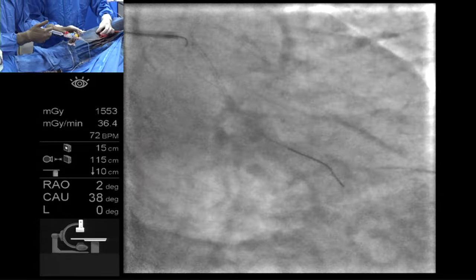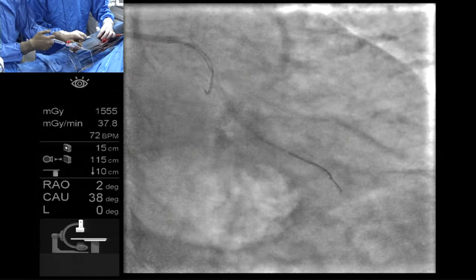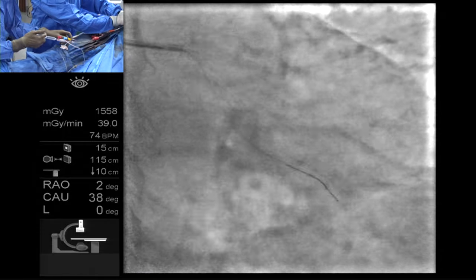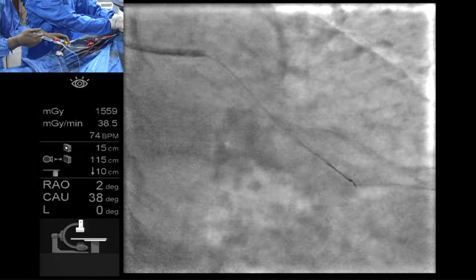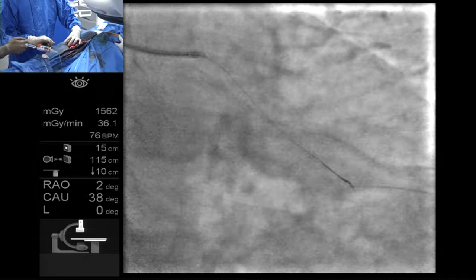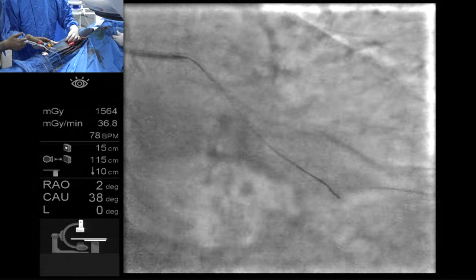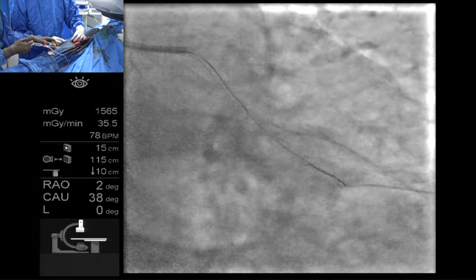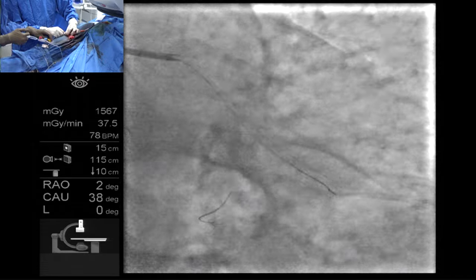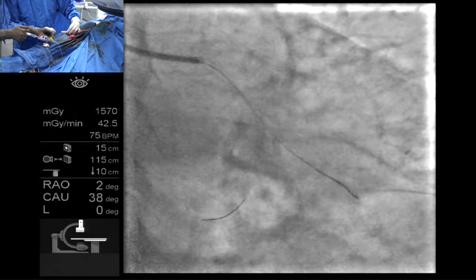I think if you push the guide and make it point up, it'll go in the left main. Yeah, that's true. Push the guide in. Wow. Radial. That's why the left radial is not a good position. Oh my God! Yes, we should not even go to that topic. We can spend the whole conference on it. It's a small branch. Yeah, okay, I think we're okay.